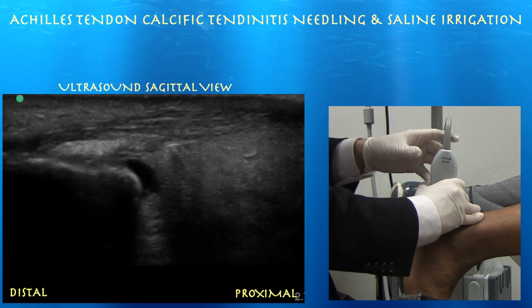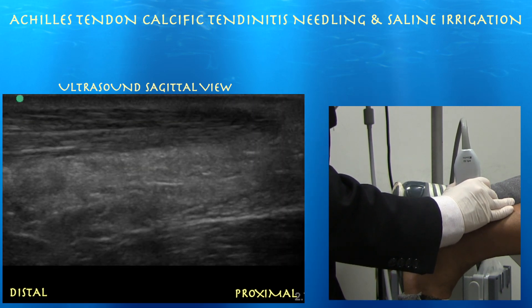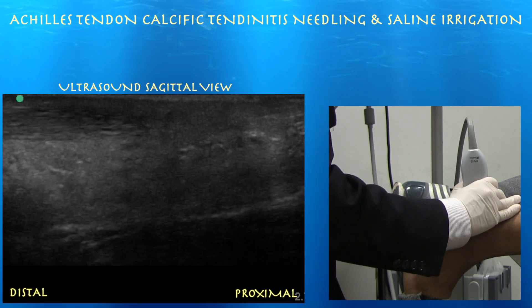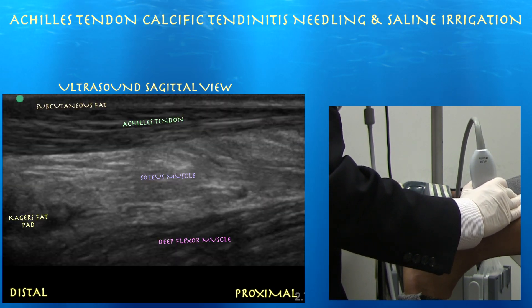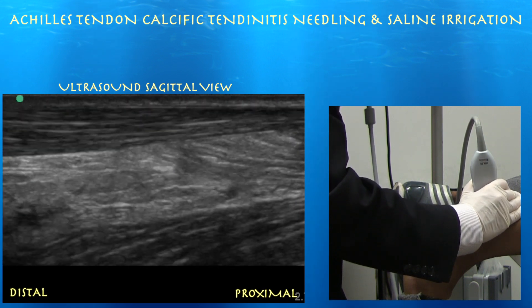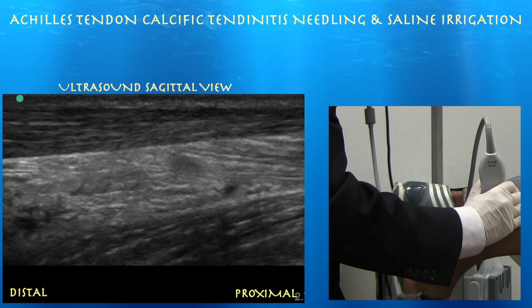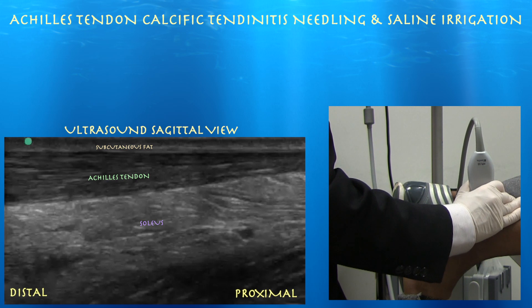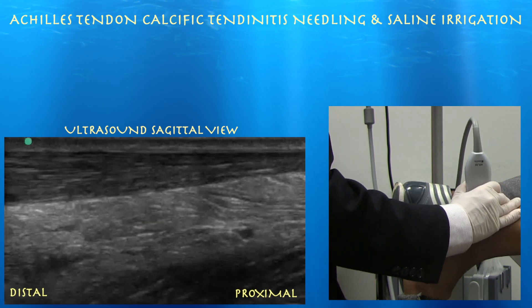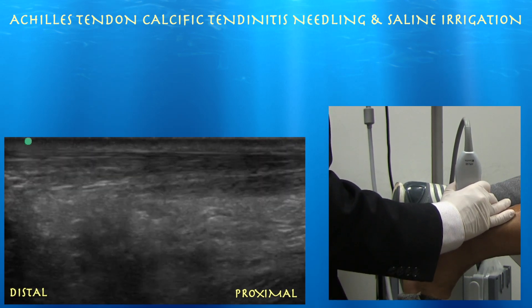Also some retrocalcaneal bursitis. Here we are going proximally. We have some of the proximal Achilles tendon with the soleus muscle underneath. As you go proximal, the Achilles tendon looks fairly well preserved and normal. It is a little thick distally, consistent with tendinosis. Probably the flexor hallucis longus muscle just underneath that. Going from proximal to distal now, you can see the Achilles tendon coming into play — it does look thickened with a little hypoechoic signal, consistent with tendinosis.